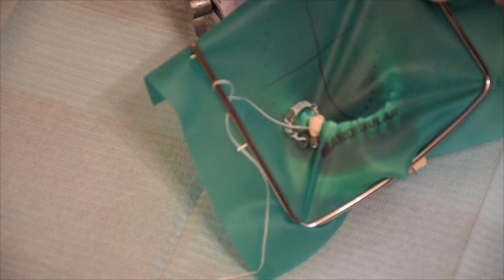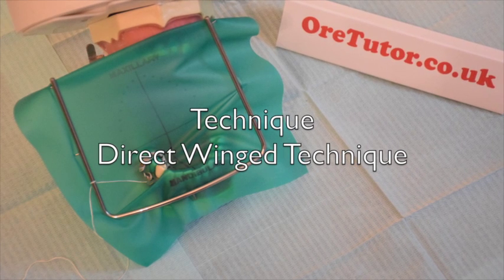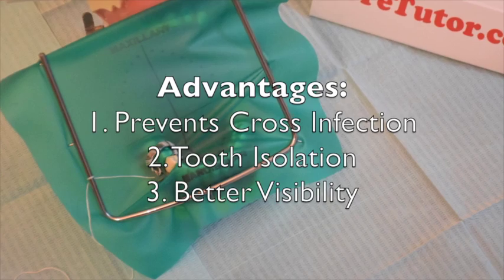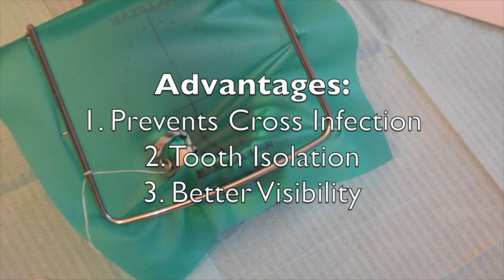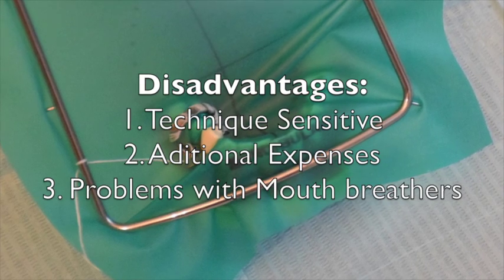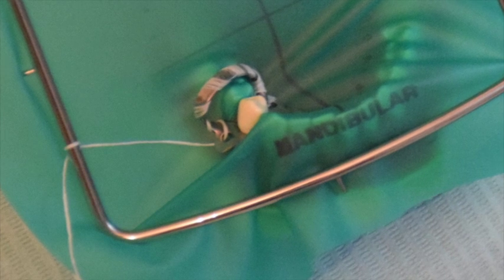As you can see, we've just isolated the lower right first premolar for endodontic treatment. In your OSCE, they may ask what technique you used — this was the direct wing technique. If using a wingless clamp, it would be the direct wingless technique. Advantages of rubber dam: number one, prevents cross-infection; number two, isolates the tooth from the oral environment; number three, provides better visibility. Disadvantages: it is technique-sensitive, it is costly, and it can cause problems for patients who breathe through their mouth.